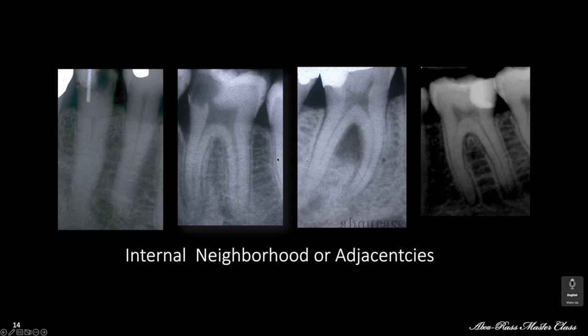The next item, DIF, is what I call the neighborhood item. What's a neighborhood? Actually, what I mean is the adjacent structures. The neighborhood here is the pin, and pins create cracks, and this creates the calcification you see here. The neighborhood here is caries. The neighborhood here is pulp cap. The neighborhood here is a provisional restoration, meaning coronal leakage. So we need to look at the neighborhood, the adjacencies to the pulp chamber.